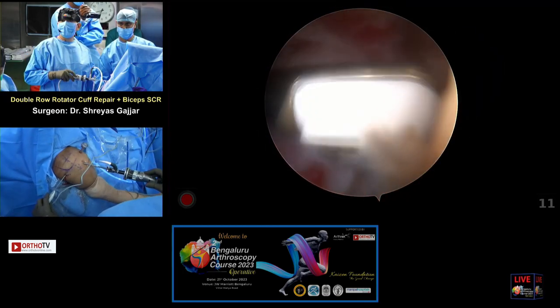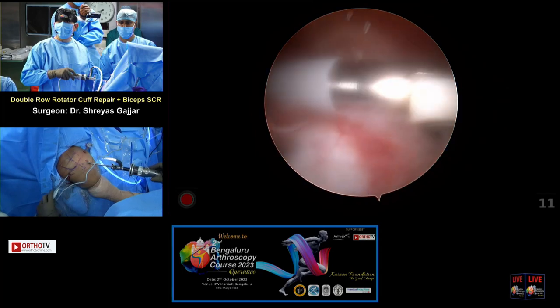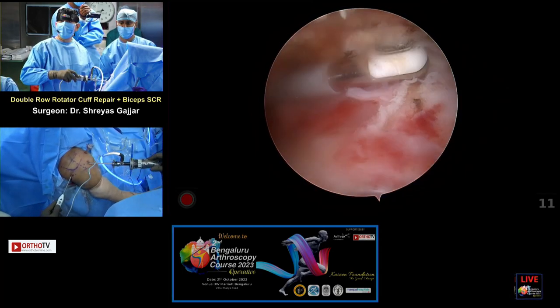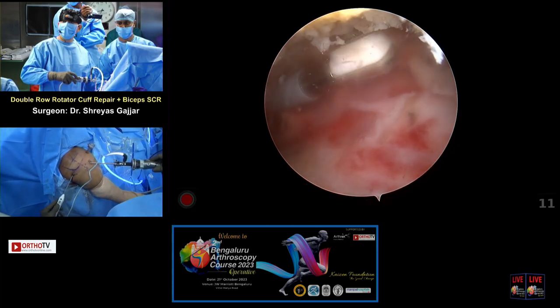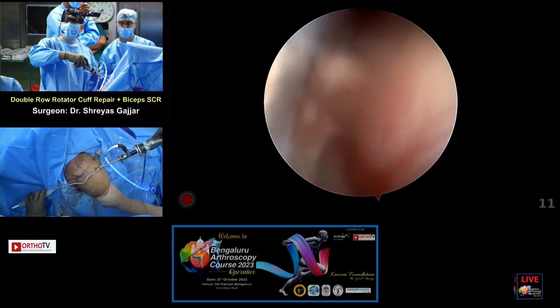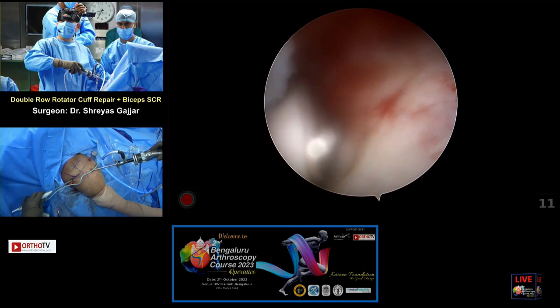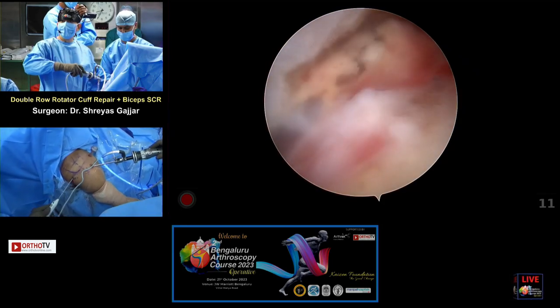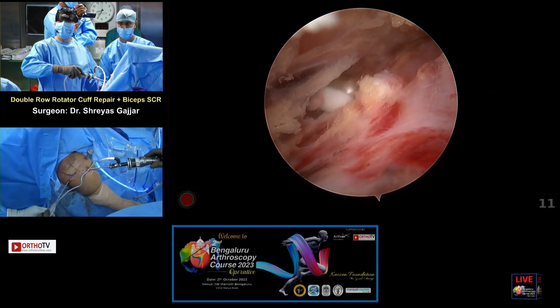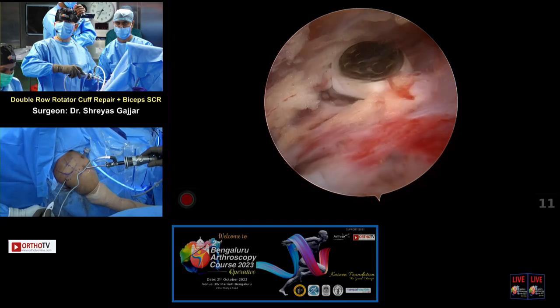I think this is quite a very good thing what you're doing, because sometimes we fail when we keep our viewing portal through the posterior and try to clear the posterior side. But now keeping it through the anterior lateral portal and cleaning it from the posterior portal is very nice. Thank you. Yeah, that's good. There's always a bleeder here at the back. So we just need to make sure we have good vision and hemostasis.